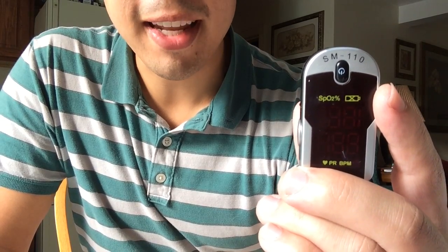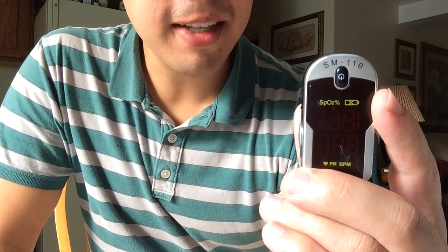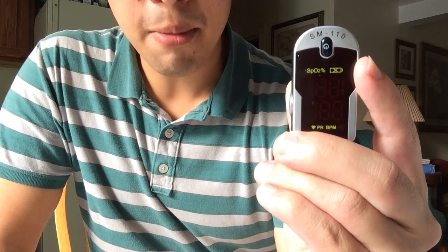Hey, welcome to Drive By Reviews. Today we are looking at the finger pulse oximeter SM 110. Right now you can find this on Amazon.com for about 20 bucks, which is way down from when I bought it a couple years ago.